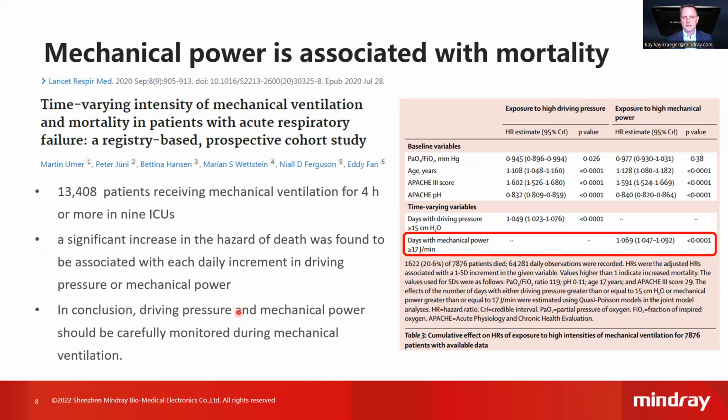We should keep in mind that driving pressure is included as a factor in the mechanical power. So mechanical power includes driving pressure, but it includes even more factors, so maybe it is even more accurate in terms of providing a picture of the ventilator-induced lung injury risk.